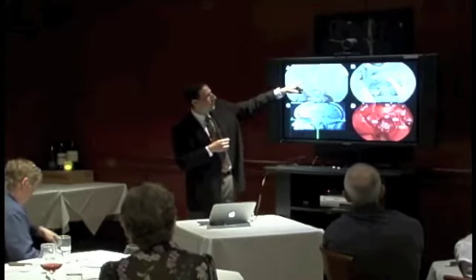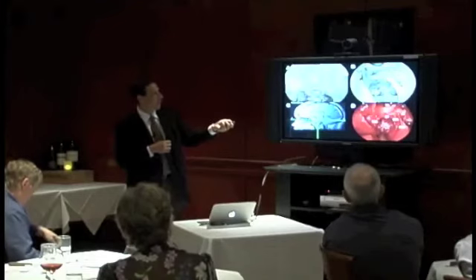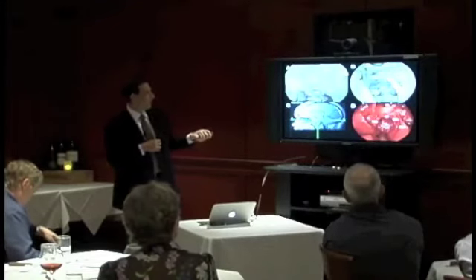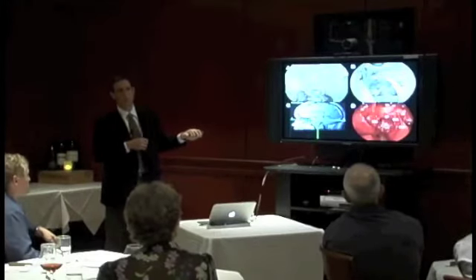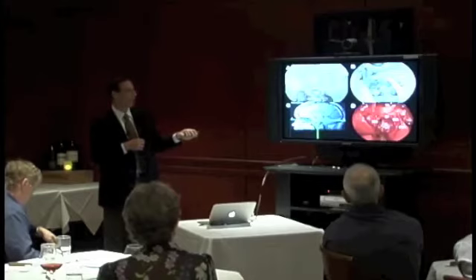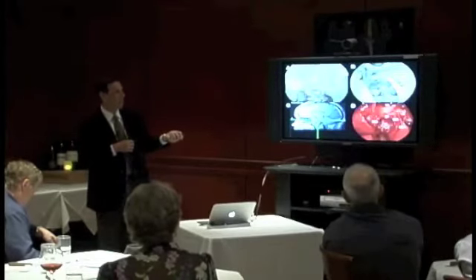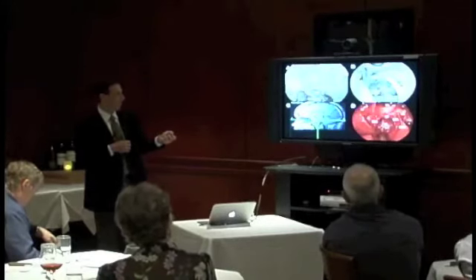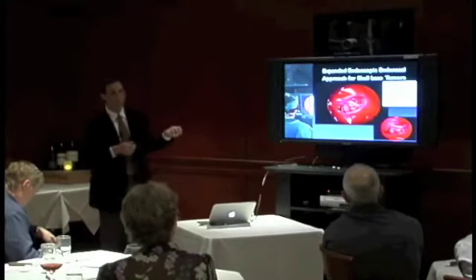Once you open up the bone and the dura, what you're going to see behind there is the basilar artery right here, the posterior cerebral arteries, and the brainstem. So here we are with our endoscope, using our image guidance to make sure that we are where we think we are, because this is, again, very valuable real estate. Here we are drilling out the clivus. And actually, we're debulking tumor there. This was a very fibrous tumor. Carotid arteries here, carotid arteries here. Sella is up here. We open up the base, and then once we open up the dura, there's the basilar artery.